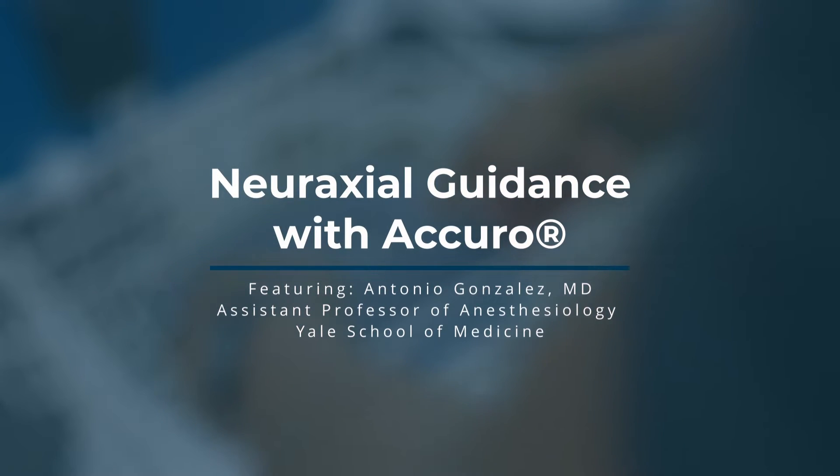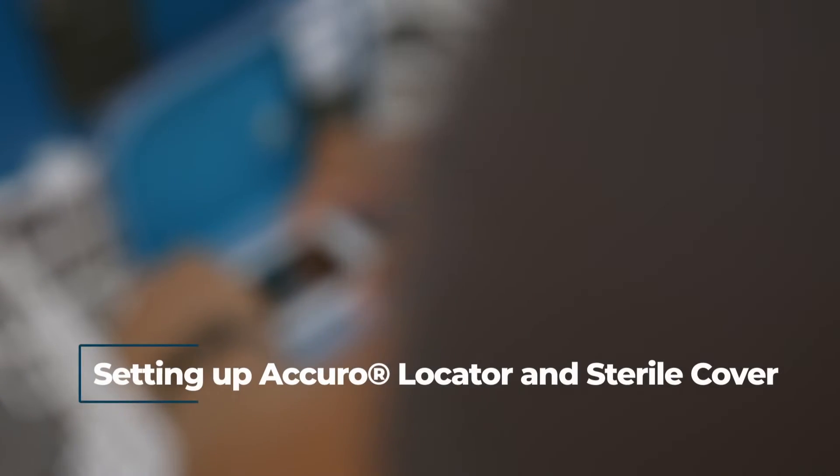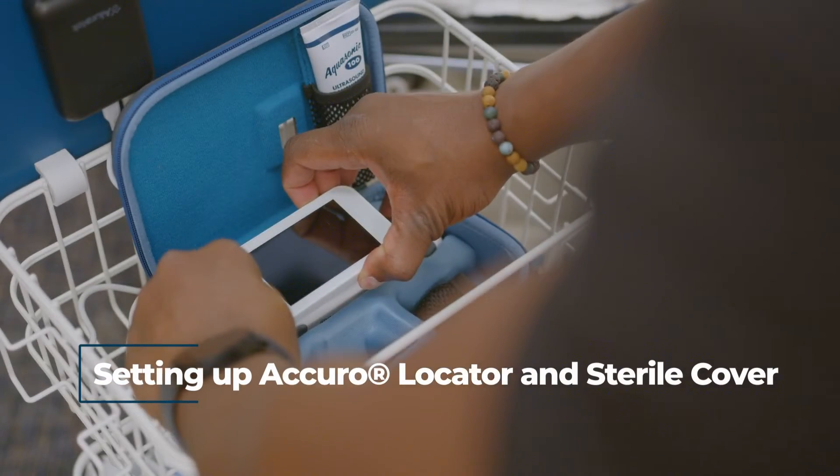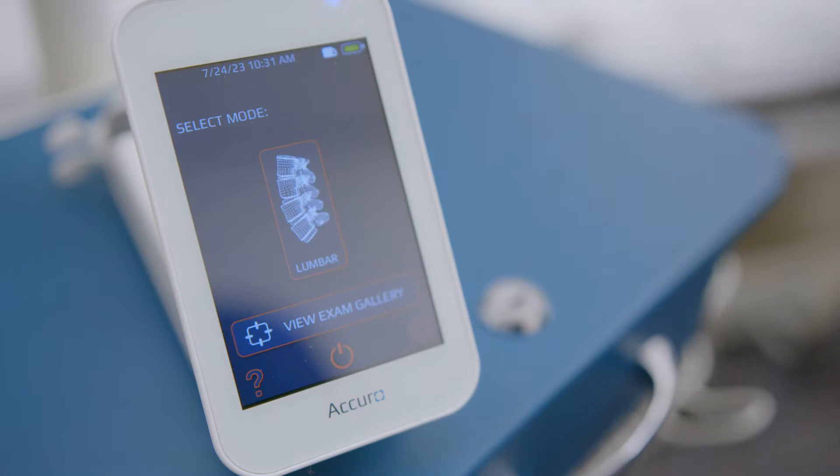Welcome to NeuroAxial Guidance with Acuro, featuring Dr. Antonio Gonzalez. To begin setting up the Acuro locator and sterile cover, first turn on Acuro and select lumbar mode.